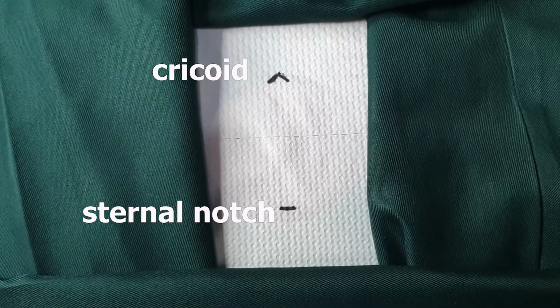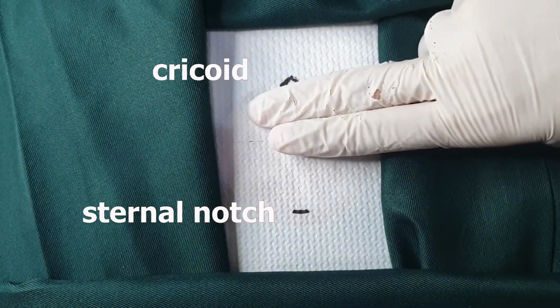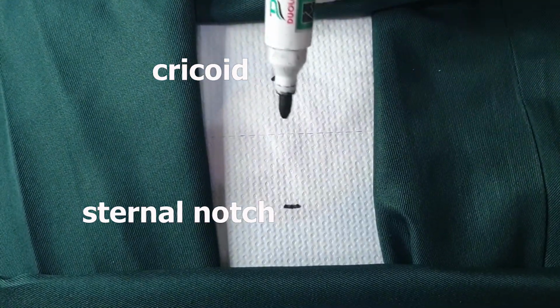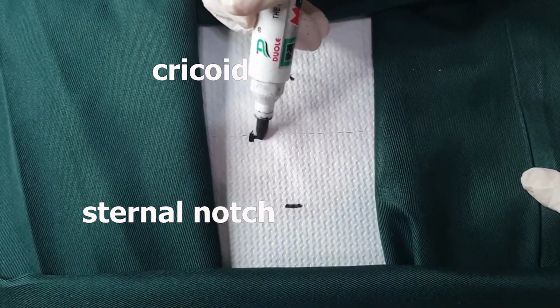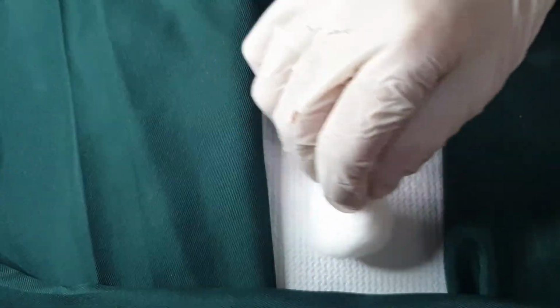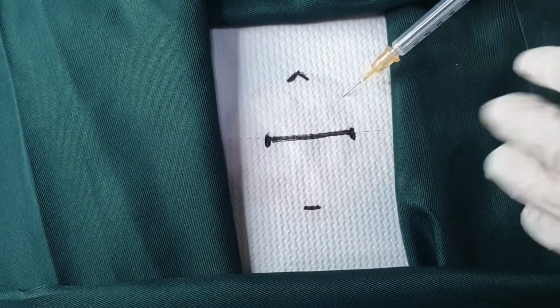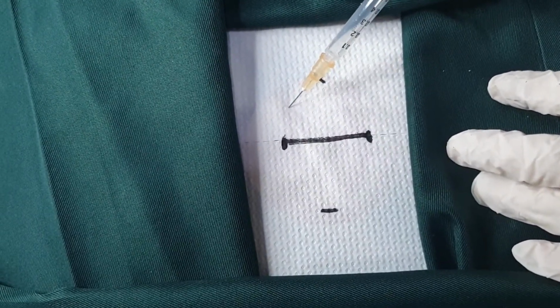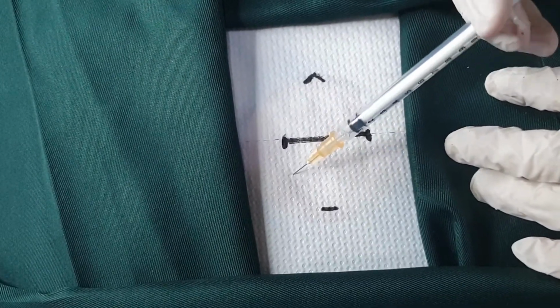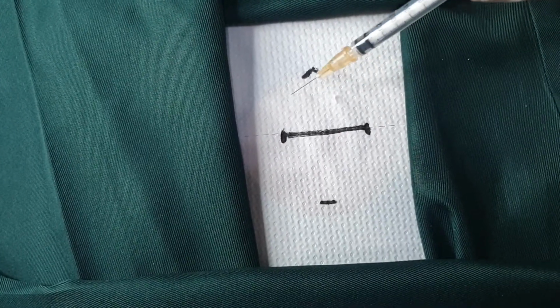For the procedure, prior to proceeding, palpate and identify the hyoid, thyroid, and cricoid cartilages. A 2 to 3 cm incision should be marked at the approximate level of the tracheal ring, 1 cm below the cricoid. Sterilize the skin of the anterior neck and chest and drape the neck. Inject the local anesthesia. Make sure that it has taken effect before making an incision.